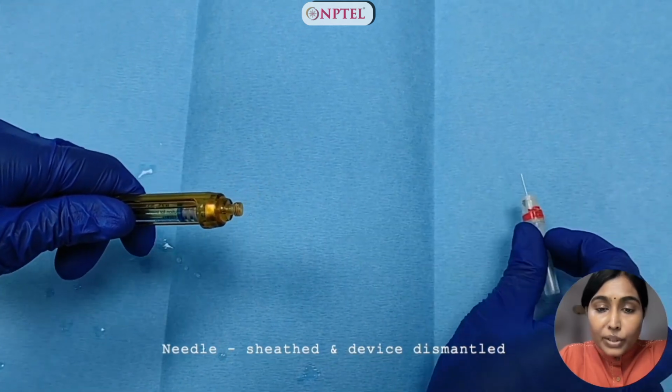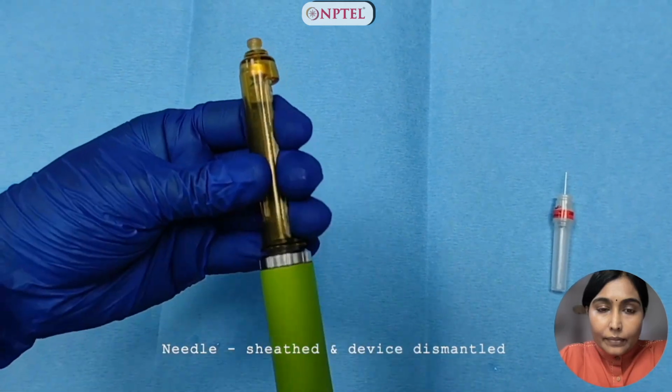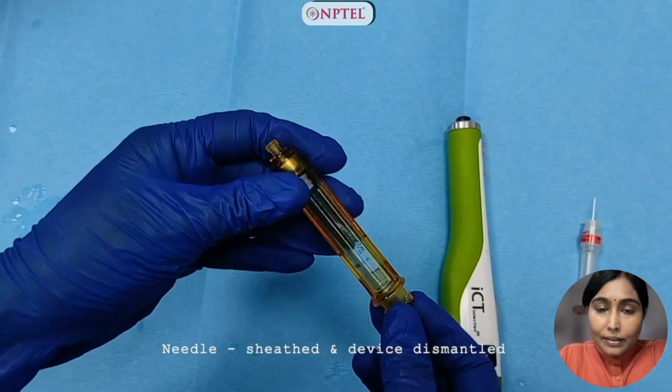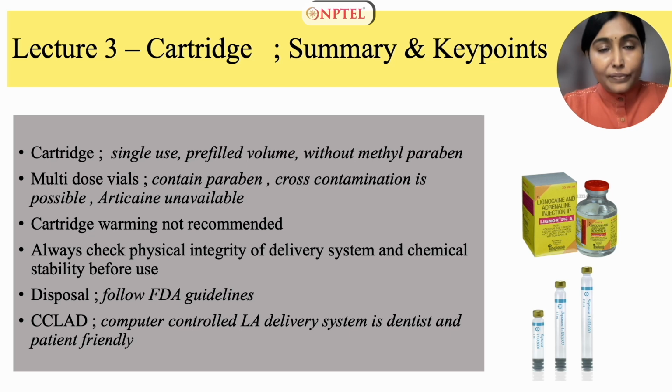The needle is removed carefully. I am removing the cartridge holder and the cartridge is removed. With this, we come to the end of lecture 3.